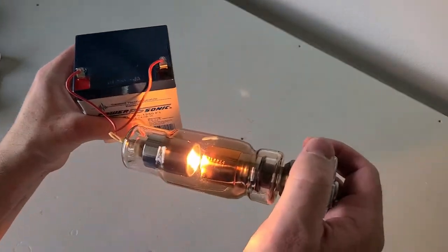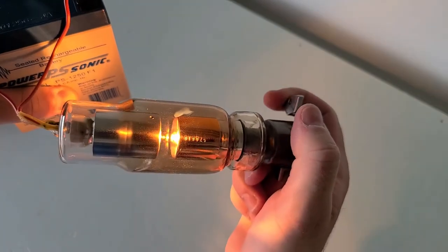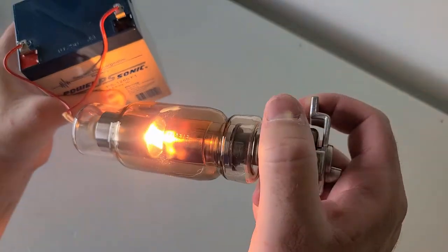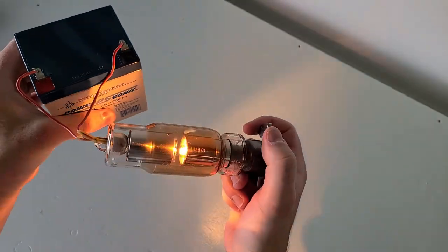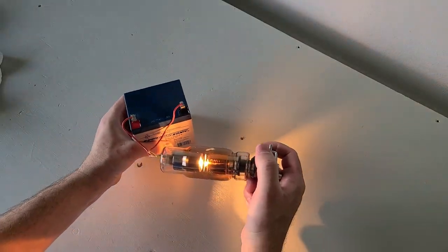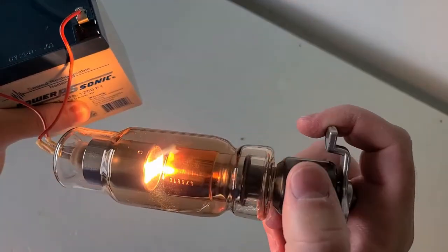Let's go ahead and show it a little closer. Yeah, that's it all lit up, it's pretty cool. Let's get a close-up here.